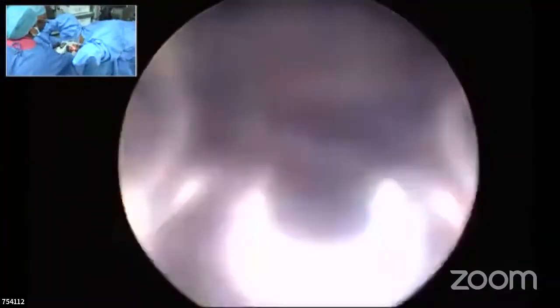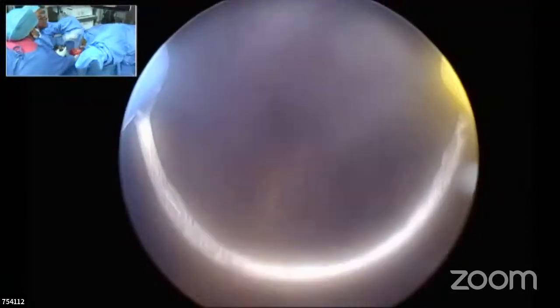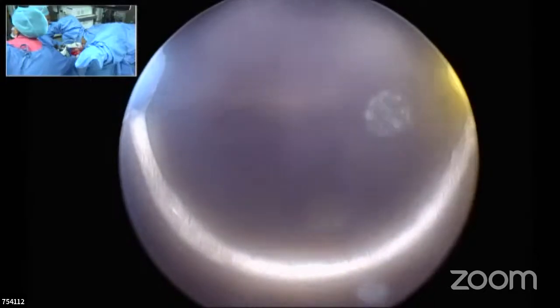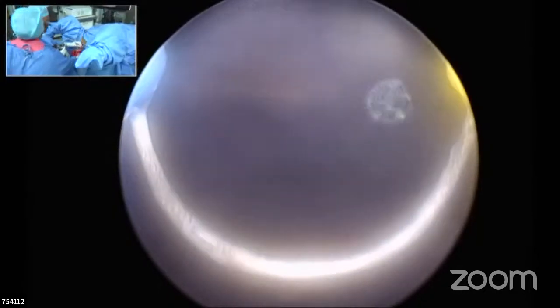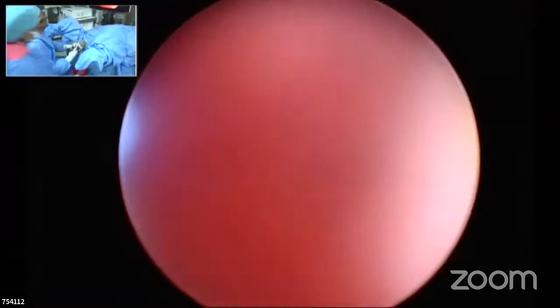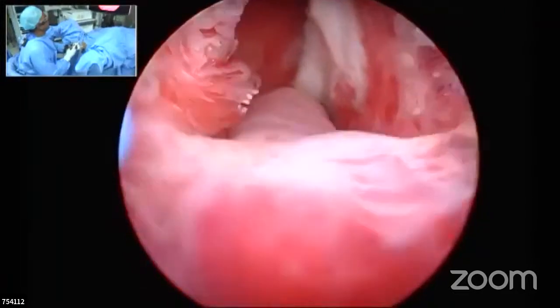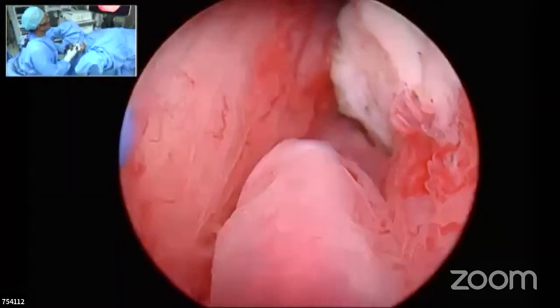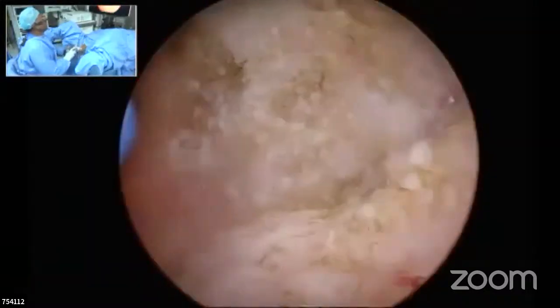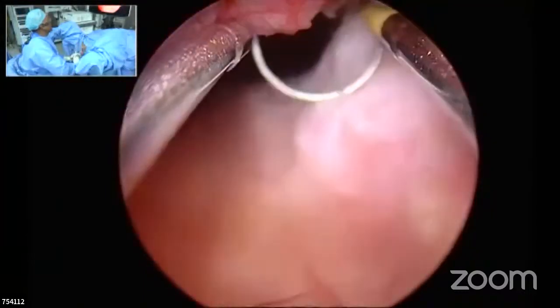I have used both. The Curis and the Storz Autocon are very good when you cut. But I have used the local bipolars, and they're not as good as Curis. There's a difference in the machine also. Olympus and Storz have got very good bipolars, but the local Indian make bipolars are not as good as the Olympus one. Agreed.